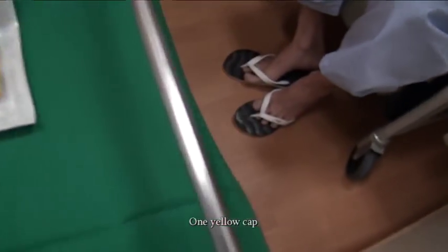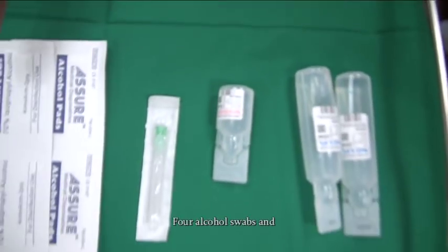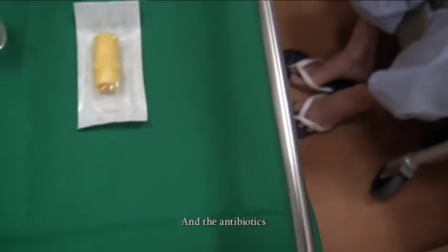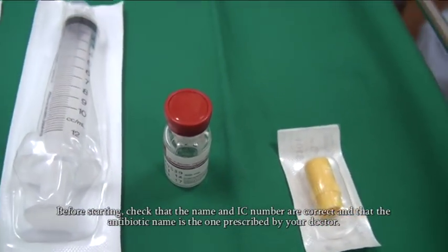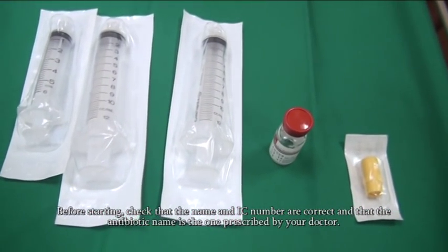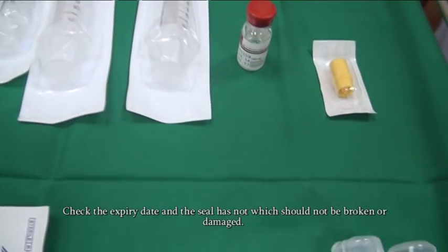1 yellow cap, 4 alcohol swabs, and the antibiotic. Before starting, check that the name and IC number are correct and that the antibiotic name is the one prescribed by your doctor. Check the expiry date and the seal, which should not be broken or damaged.